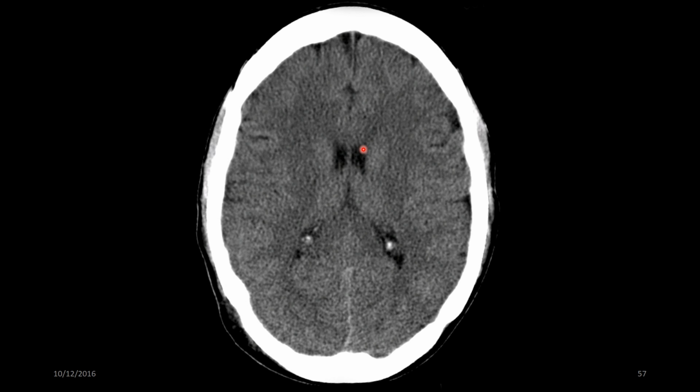And now you move on to 2016 and look at the huge detail improvement that you've got now on modern CT. So this is an axial slice from a CT head scan. So you've still got those ventricles here. It's just a different slice through the head. It's referred to as a slice because you look at all of the images. So you've got cortical bone around the edge. You've got grey matter and white matter. These are your calcified choroid plexi. And it's a massive, massive improvement over what you could see back in the day.